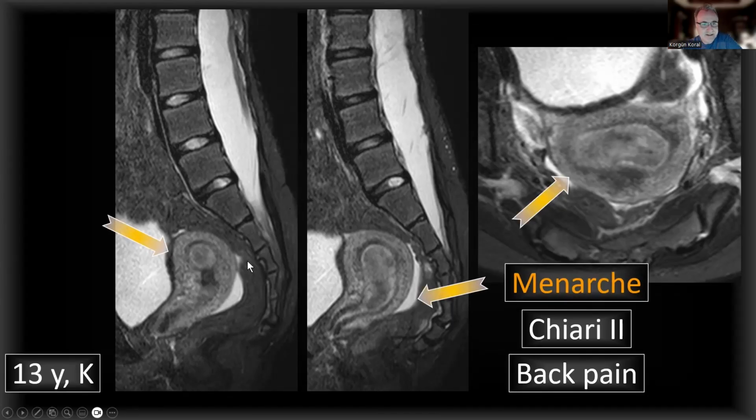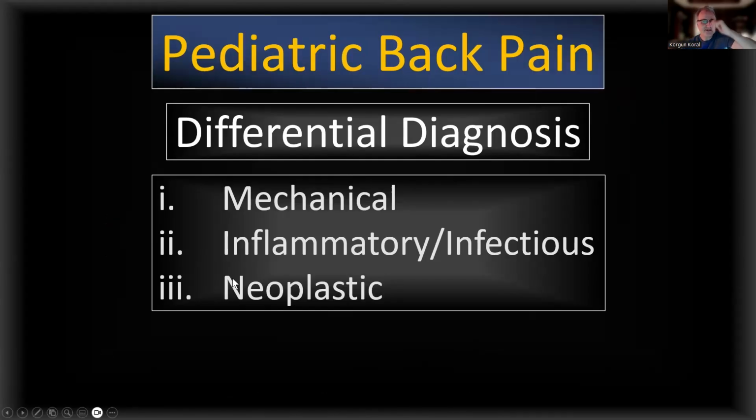So one can diagnose the cause of the back pain if one looks carefully at the spine MR images. So in this talk, I went over the differential diagnosis of pediatric back pain. Mechanical, inflammatory, infectious, and neoplastic causes were stressed.